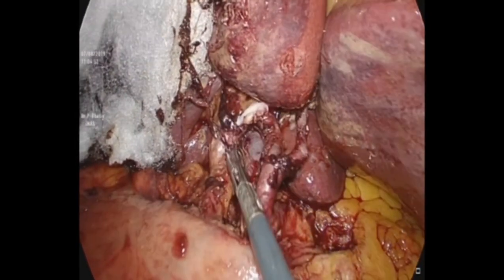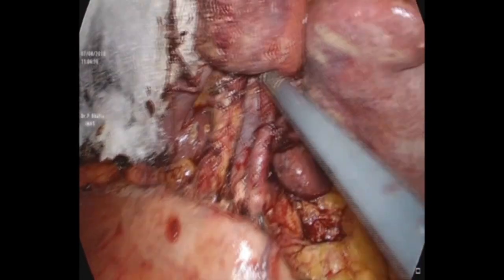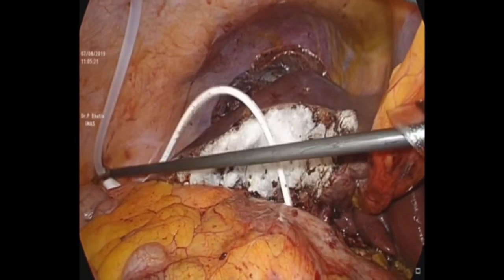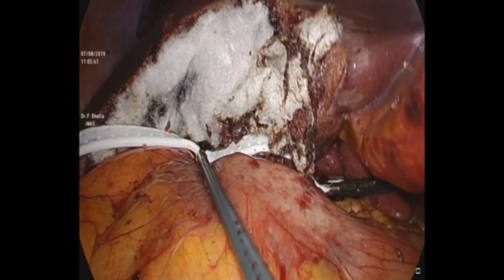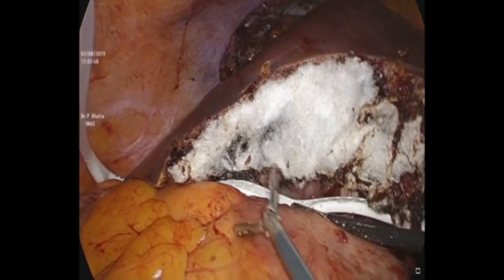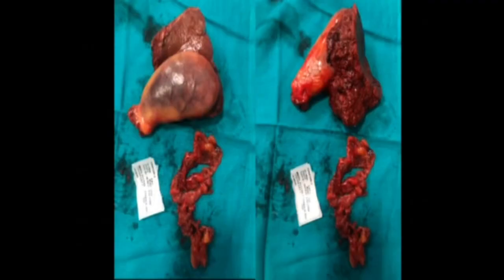The anatomy is again visualized — check, recheck, cross-check, counter-check. We then believe in placing a Jackson-Pratt drain. Normally, we would discharge the patient on day 2 or day 3 with the drain in situ.